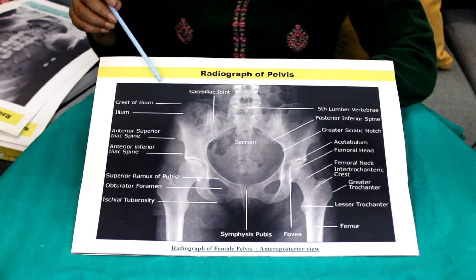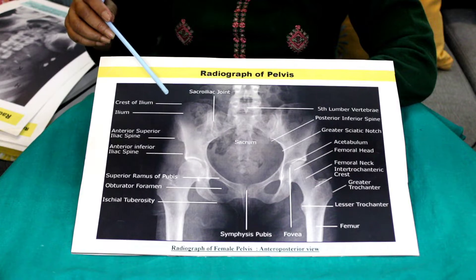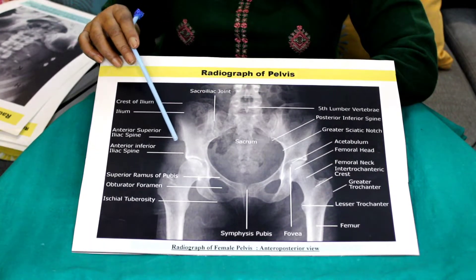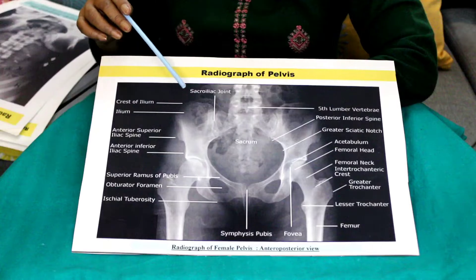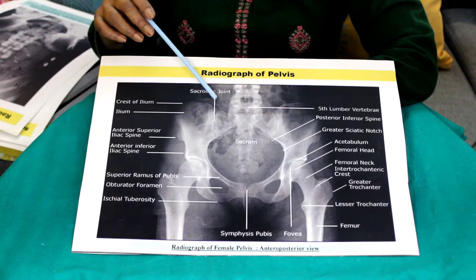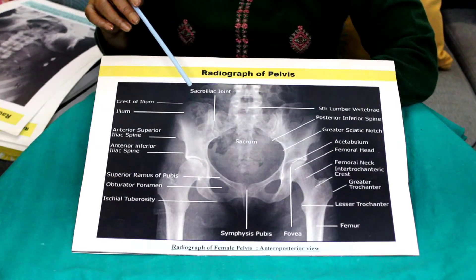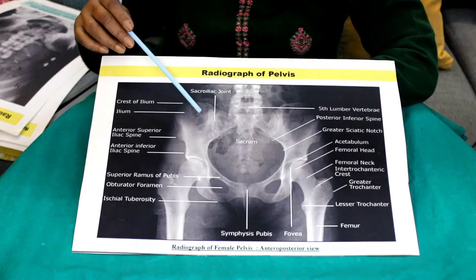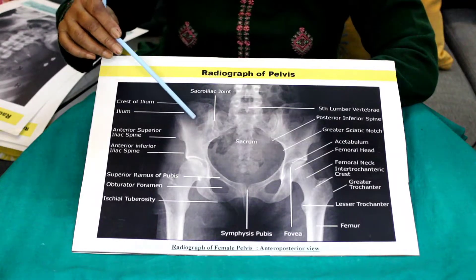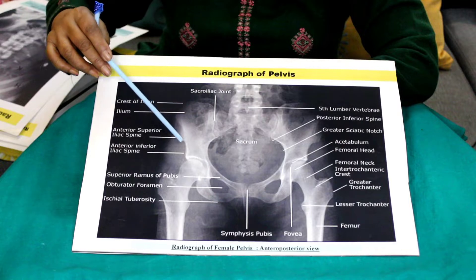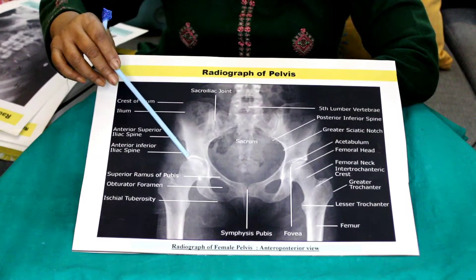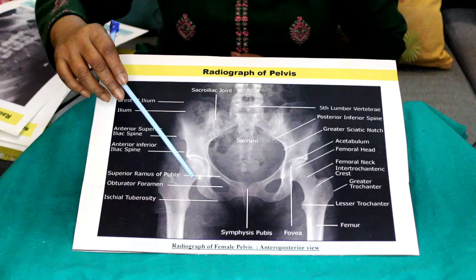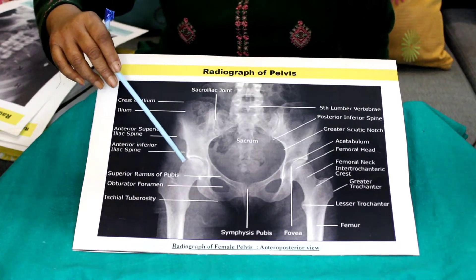Hi everyone. This is the radiograph of the hip joint anteroposterior view, or you may say this is the radiograph of the pelvis. In this you will see the outline of the hip bone, and you can see this is the acetabular margin and this is the acetabular cavity.